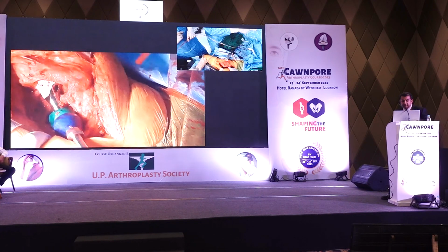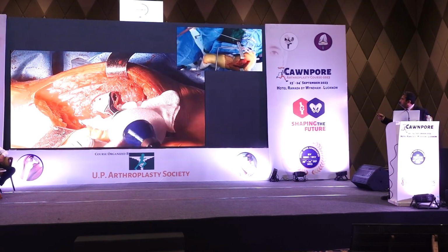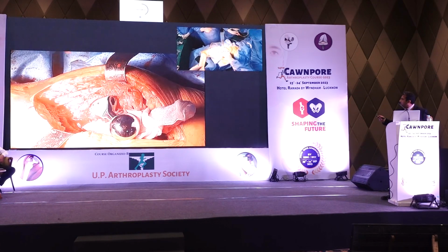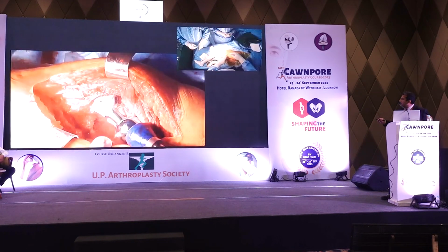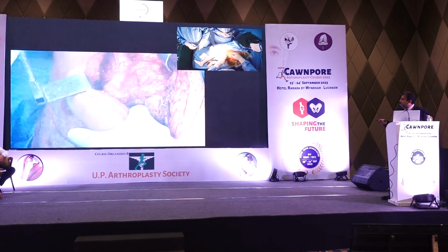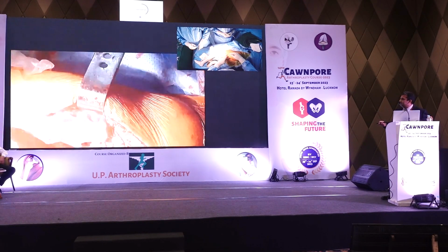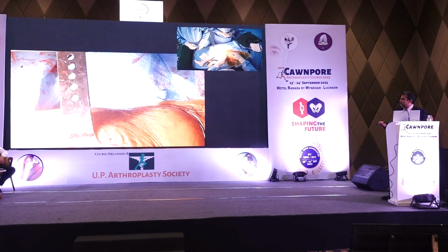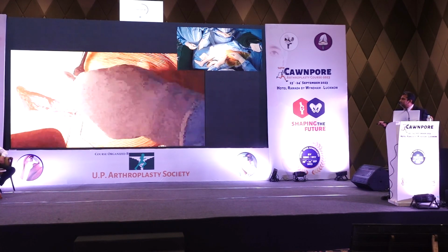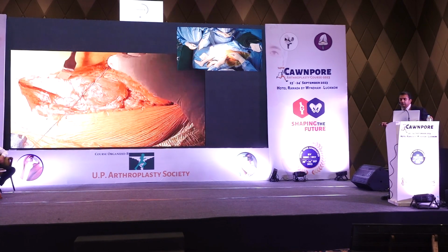And then I do the reduction. And you can see in the top view, I am trialing in all the positions, full extension, no tightness. And you get good intraoperative stability. So this way you bypass the screw holes so that there are no stress risers, and you get a good leg length, alignment and version, and do an absolutely watertight closure.